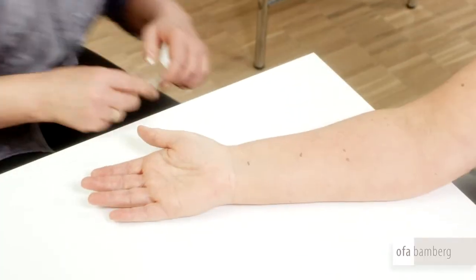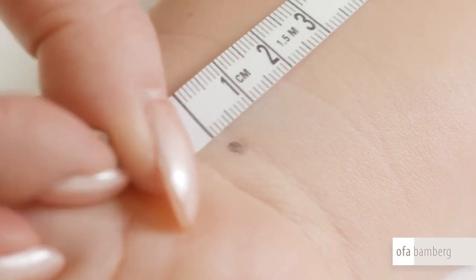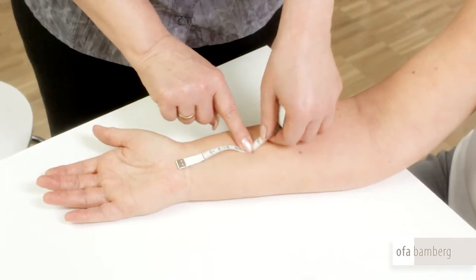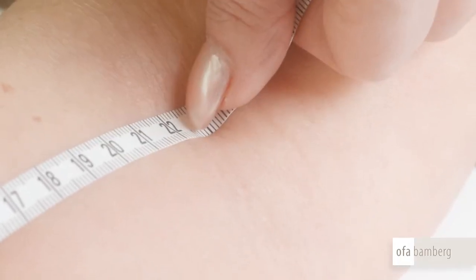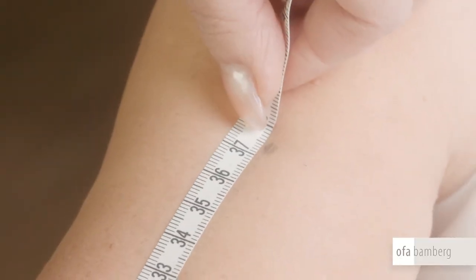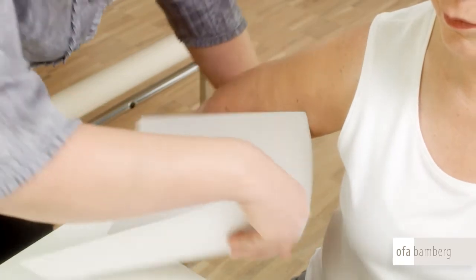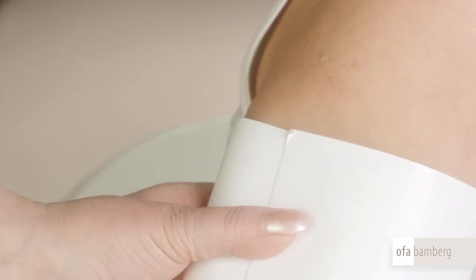By means of your markings, you can now measure the lengths on the inside of the arm. The patient's arm should be extended. Always start at point C and move along your markings on the arm. Measuring point E is located directly at the crook of the patient's arm. Proceed to measuring point G. To mark measuring point G on the outside of the arm, use a cardboard which you bend around the patient's arm and then make a marking at the upper edge of the cardboard.